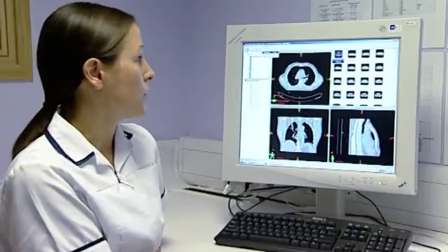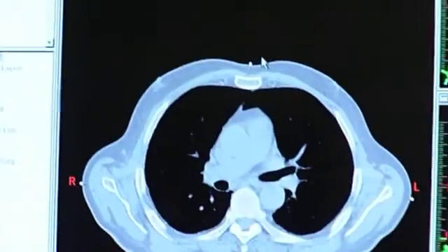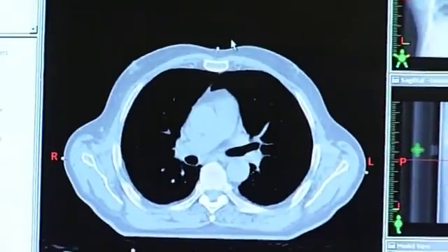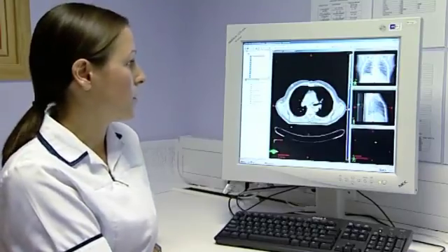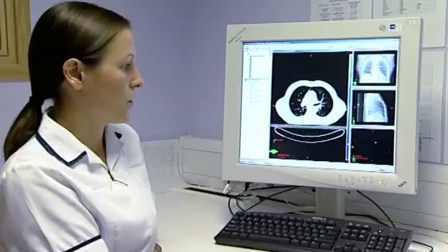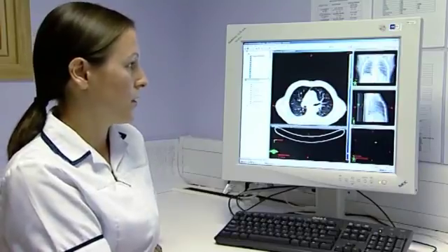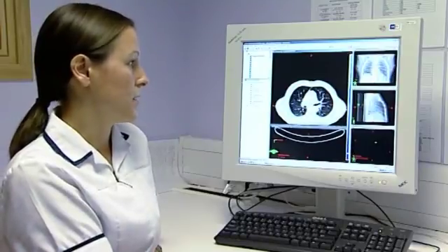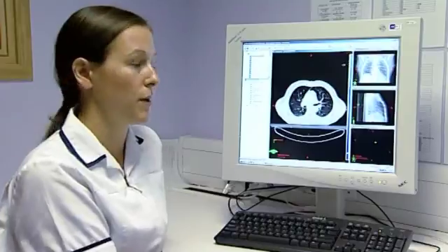We move on to contouring. This is all done in the transverse plane only, and to mark up the tumour volume, the doctor would use a lung window so it's easier to visualise the extent of a tumour.